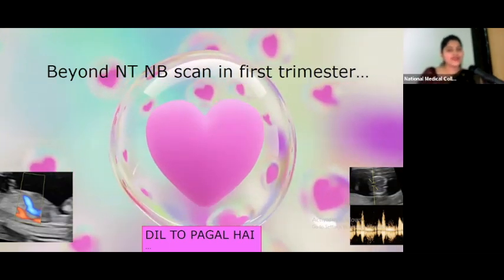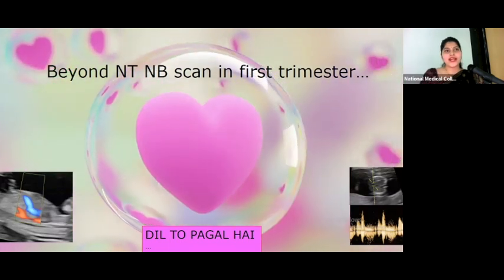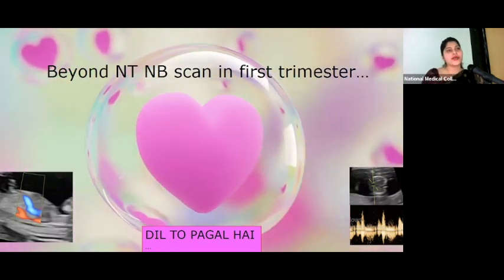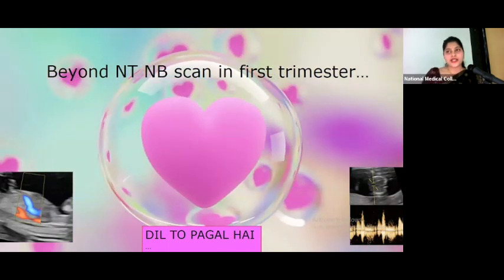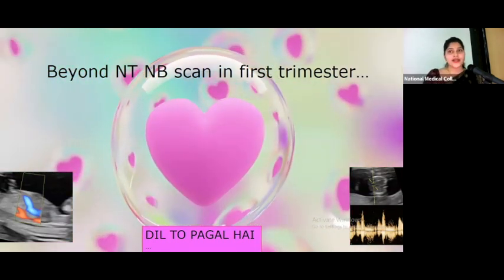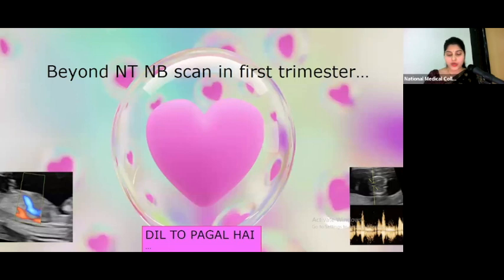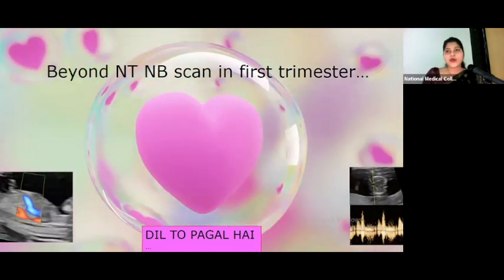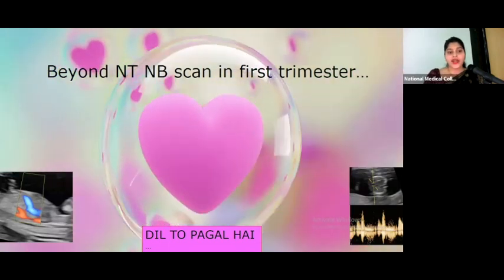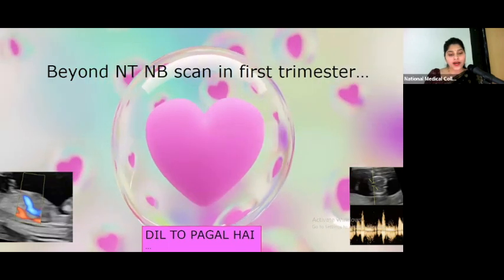Good afternoon, everyone. Till now, we have seen how history, examination, and genetic investigations help in managing patients in our OPD. Now we will look into the ultrasound, which is the most essential tool at our disposal. Obstetricians are the only clinicians who see two lives at a time, including fetus and the mother, and ultrasound helps in managing both.